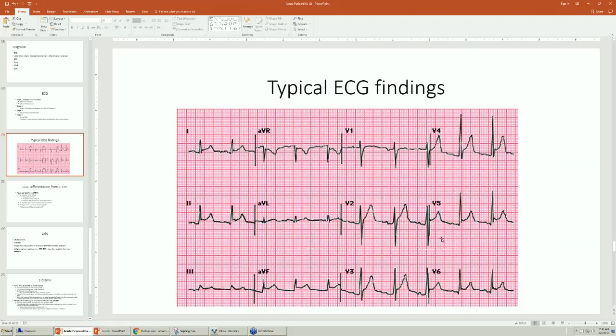Pretty extensive MI. And they say, well, it's hooking the inferior wall and going in the inferior interventricular sulcus, supplying maybe a third of the inferior wall as it hooks around the apex. But then you go up here, and this clinches it.